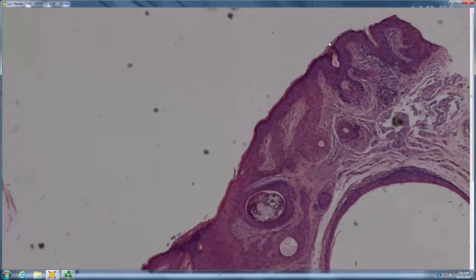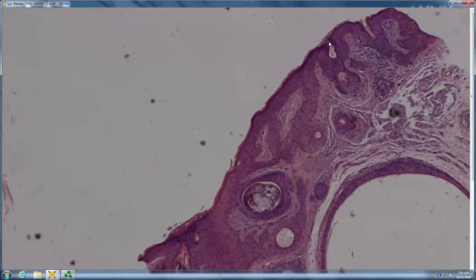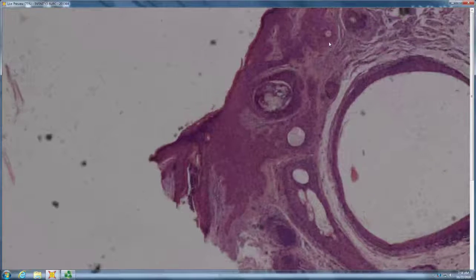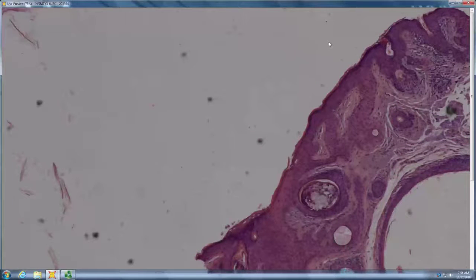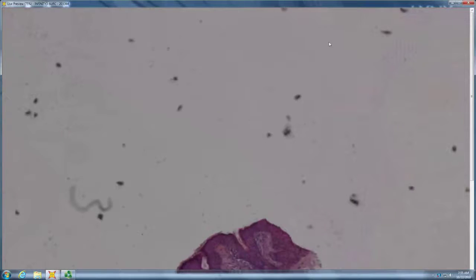Let's see. So, sun-damaged skin, acanthosis, and then cystic-like structures. So you have a dilated infundibular, cystic structure, and in fact several of them, just some bigger than the others. And then what do you have here? Acanthosis, which kind of looks like follicular infundibulum, but it hangs like garlands from the surface. Tumor of the follicular infundibulum. Correct. That was easy. Well done.